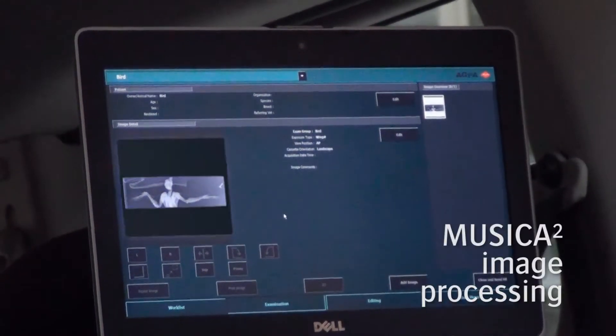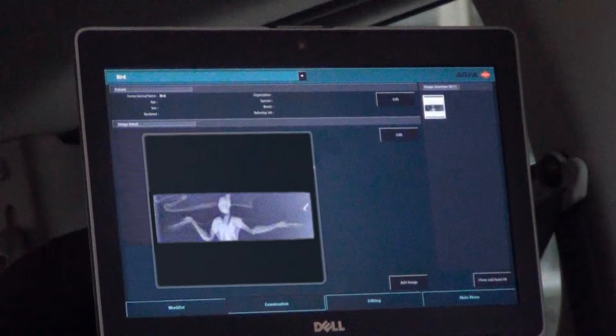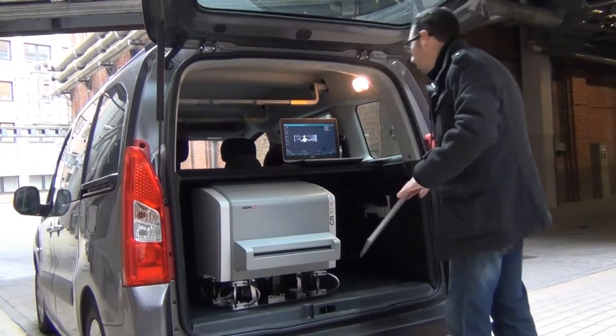Once the image is scanned, it is auto-cropped, Musica processed, and ready for diagnosis. The cassette is ready for a next examination.